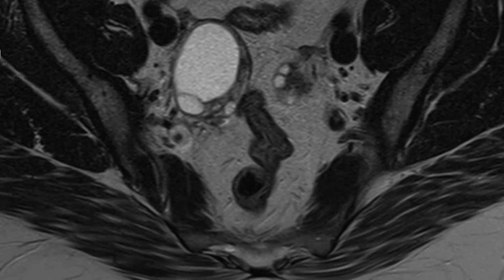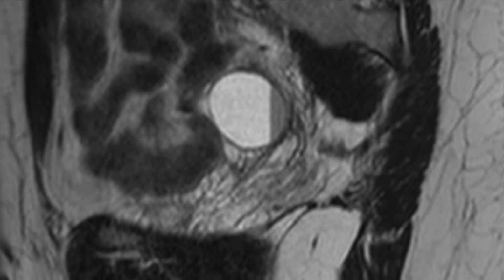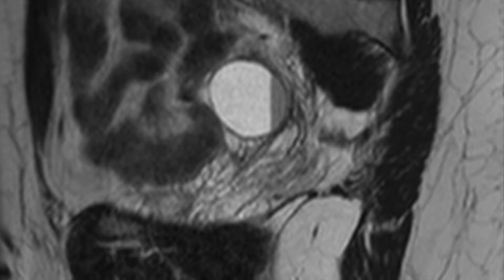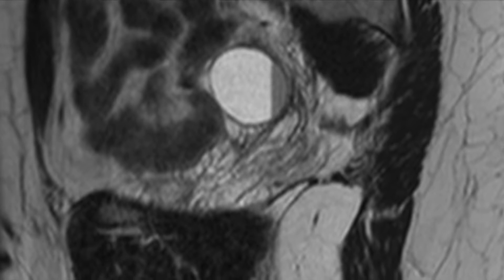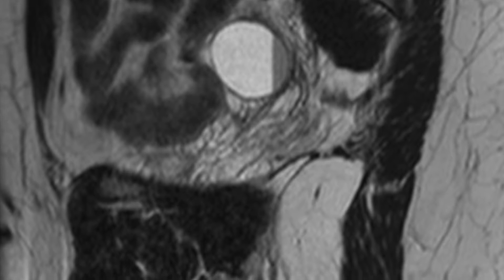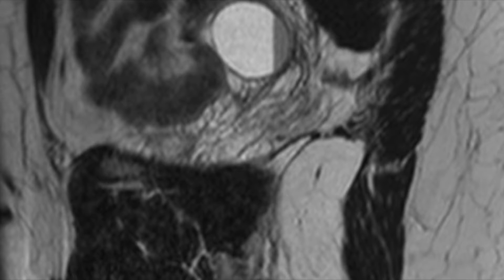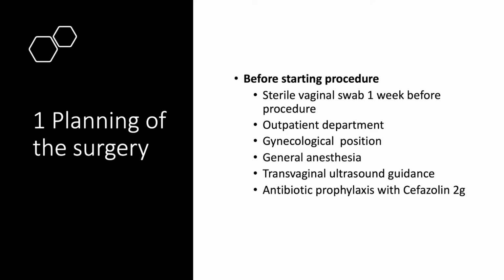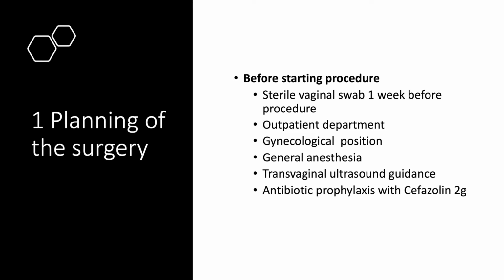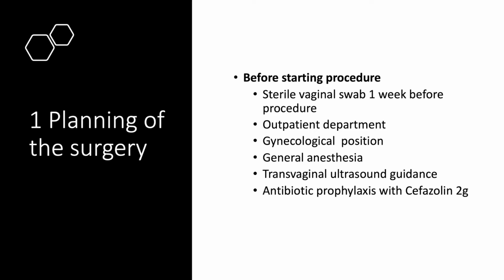As sclerotherapy is not the standard treatment, indications were discussed during multidisciplinary endometriosis meeting and appropriate information was given to all patients. The objective of the sclerotherapy was to avoid laparoscopic cystectomy and decrease the risk of ovarian reserve injury. All women had a vaginal swab to detect preoperative vaginal infection 1 week before the procedure. If it was positive, the infection was treated and the procedure was delayed.